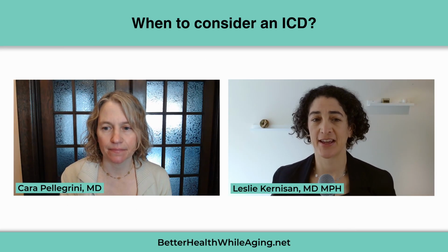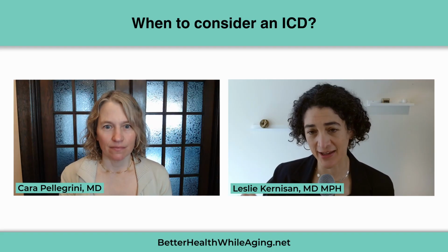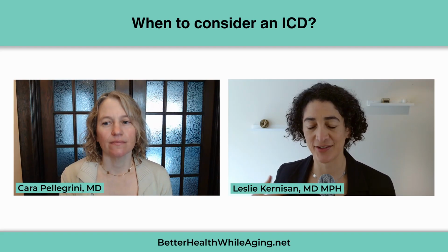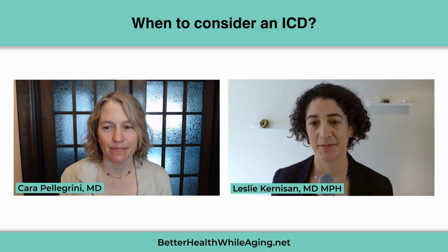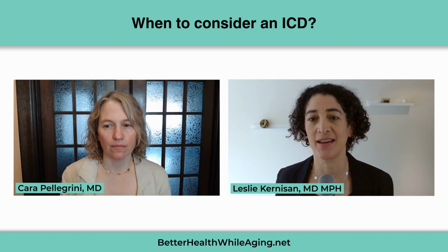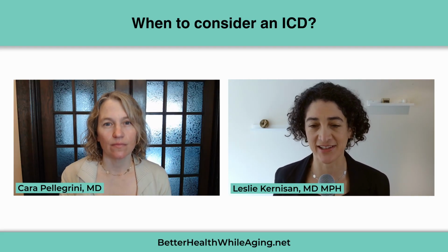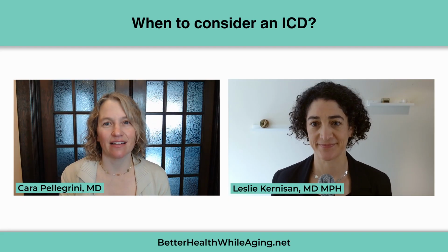Okay. And so it sounds like if a person is older and has had, again, sick sinus syndrome, we wouldn't normally be thinking of putting in an ICD for them. That's way overkill. We just need a pacemaker that will keep an eye on things and keep goosing it along. And that is painless to live with and experience. Correct. But it sounds like people who've had more complicated heart conditions or who have had this kind of life-threatening fast heart rate, those are the ones who might get a device that can administer that shock if necessary to break a dangerously out of control heart. Exactly.